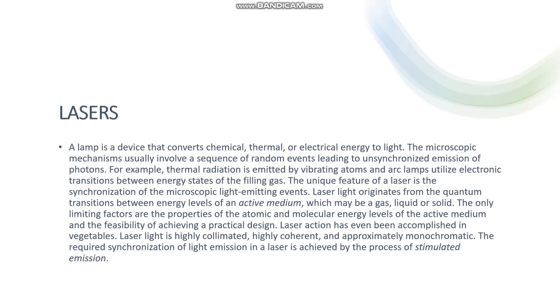Lasers. A lamp is a device that converts chemical, thermal, or electrical energy to light. The microscopic mechanism usually involves a sequence of random events leading to unsynchronized emission of photons.